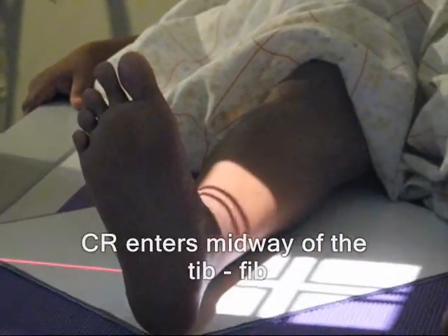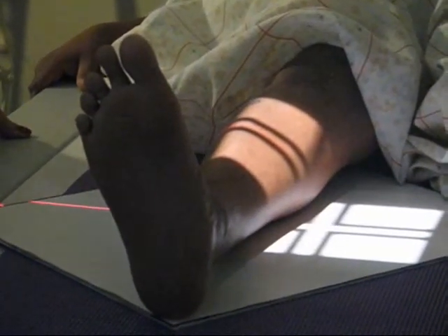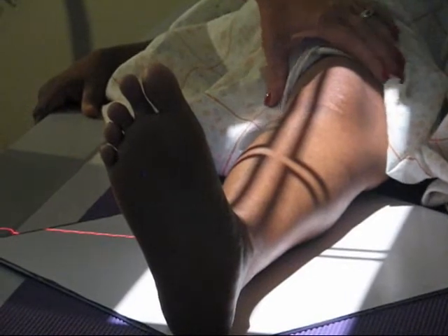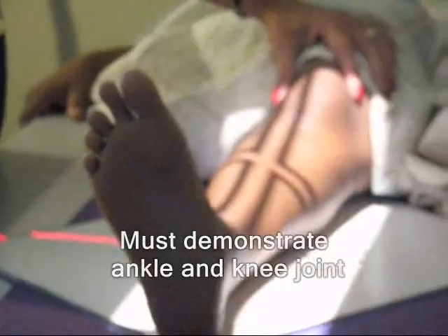The CR is going to be midway of the tib fib, and of course you're going to have to open your collimation to include both the ankle and the knee joint, which in this case is possible because our model is quite petite.